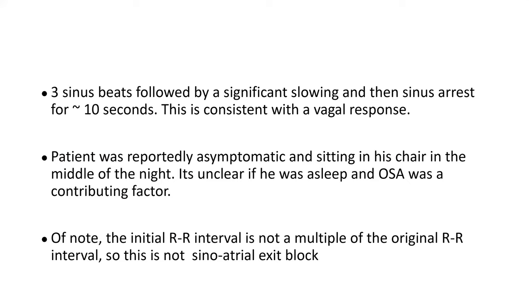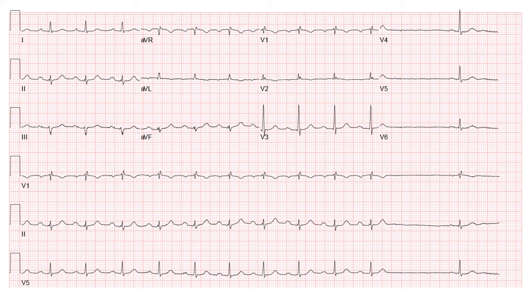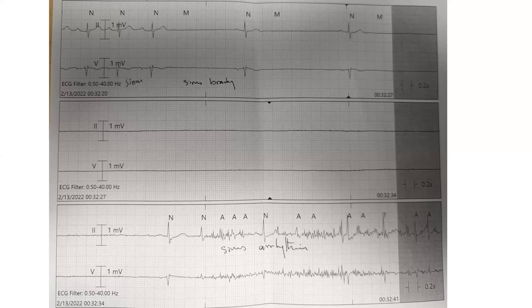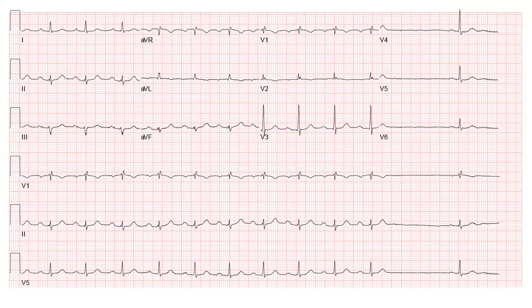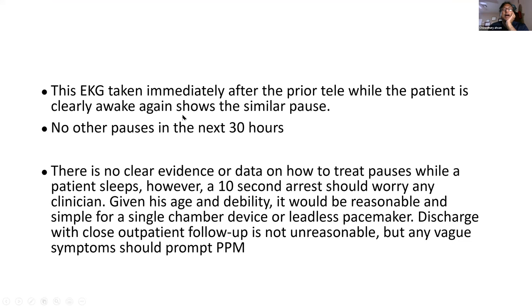Well, Hafiz, I've seen pauses up to 30 seconds. Right. And did nothing. This patient actually was seizing, if that is what I wanted somebody to comment on in the strip. If you look at the strip, after the pause, towards the end, you can see the baseline artifacts. I wonder if in sleep he was seizing or not. Without symptoms, it's difficult, and especially this patient is very sick at that time. Temporary is different, but of course, one will have to really clearly debate the role of a permanent pacemaker in this patient. And no other pauses were noted in the next 30 hours in the hospital.